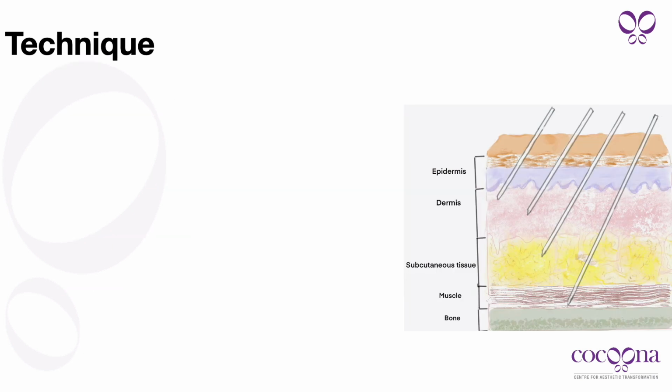So the depth of the filler injection could be just very superficial, just underneath the epidermis, for fine lines and creases.